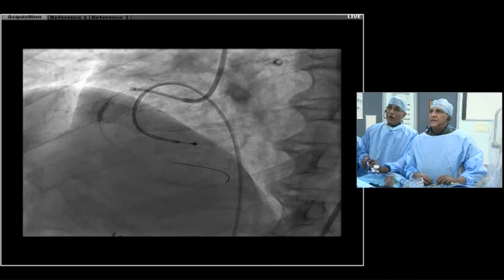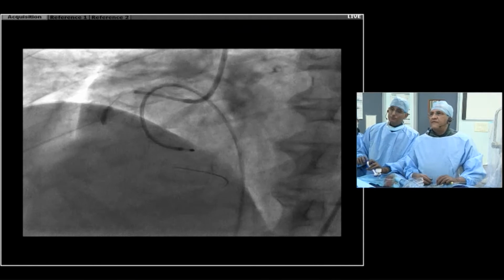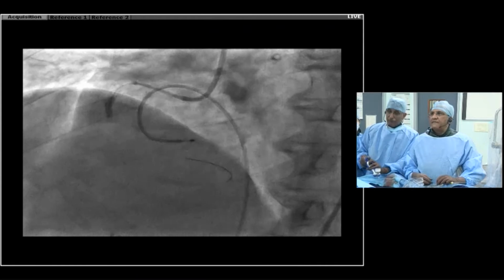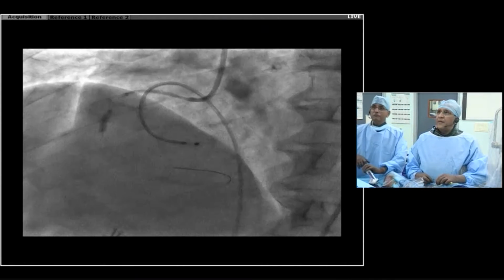We are just at 2 atmospheres. 2, 3, 4, 5, 6, 7, 8, 9, 10, 11, 12. It's nicely just the bend. It's a bend and a weird thing. That's amazing.